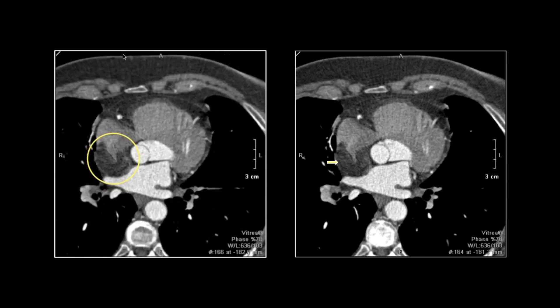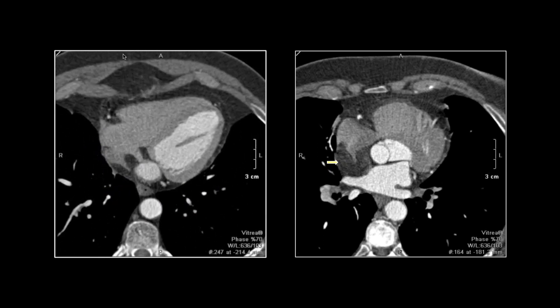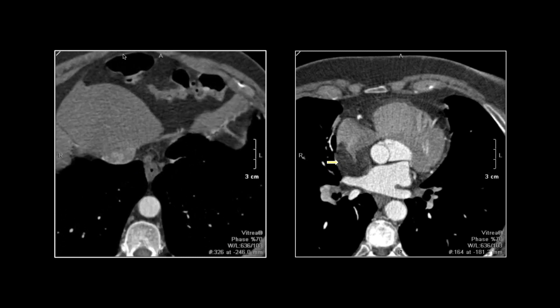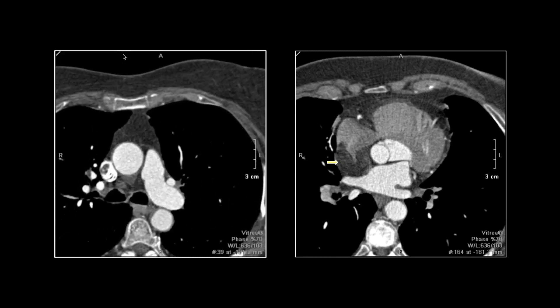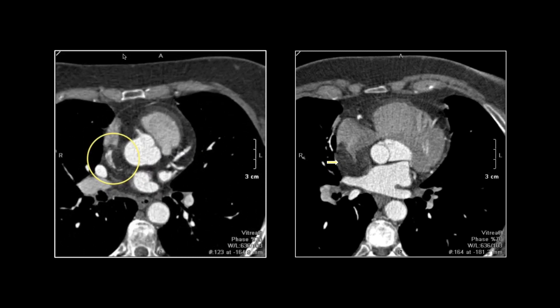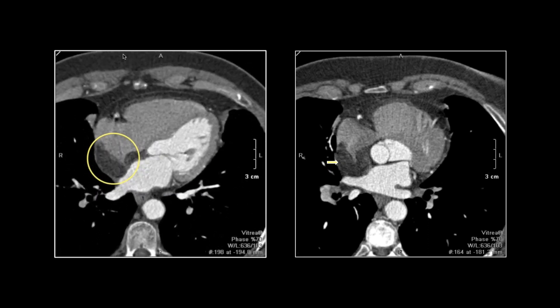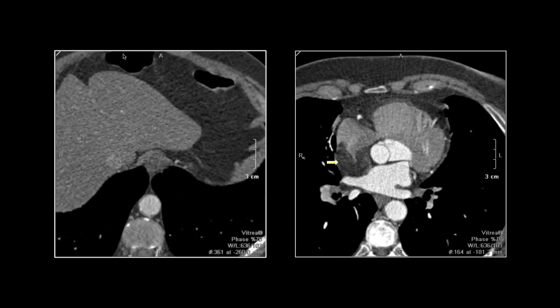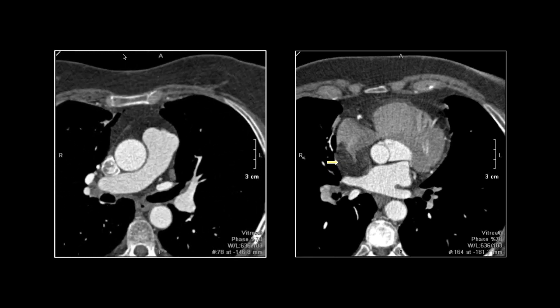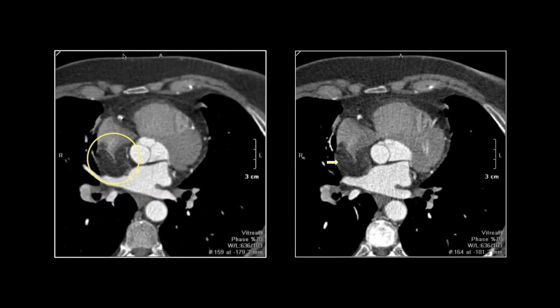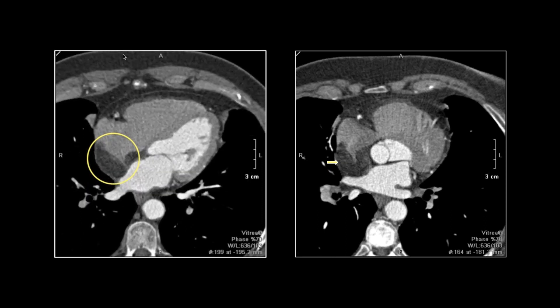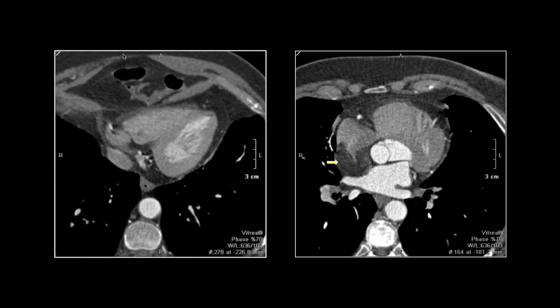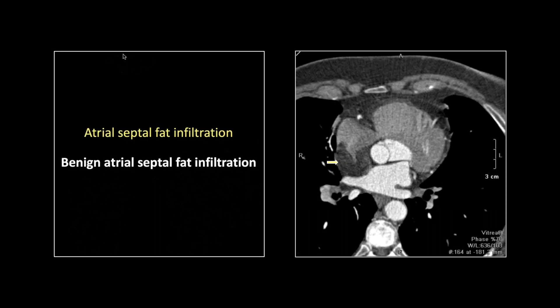In my days when I was doing these more actively, people would call me and say they thought they had a myxoma, and I would always roll my eyes and think 90% it's going to be fatty infiltration of the septum. So all that is fat is not a myxoma, and we're going to look at a myxoma and see that they don't look very much alike at all. That is benign atrial septal fatty infiltration.